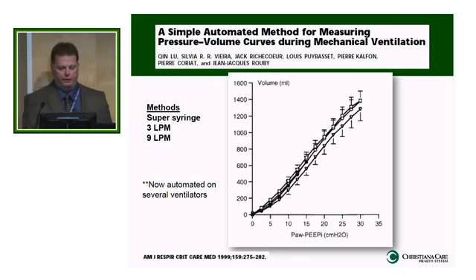But again, this is something that's kind of cool. It's come to bedside. It's FDA approved by several ventilator companies, and they have this to bring to bedside. And it's been a long time in coming. You see, this was out in 1999, this article that identified that 3 liters is probably a good flow for that.